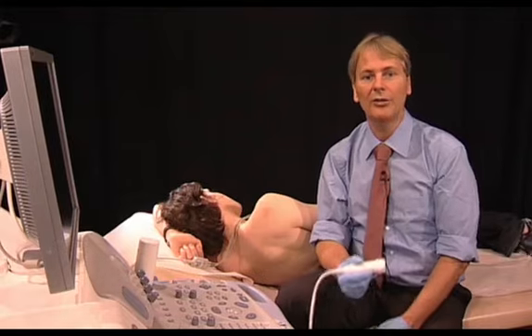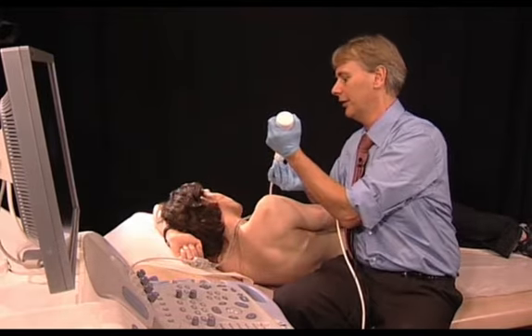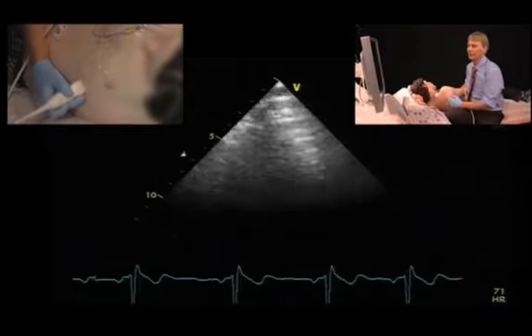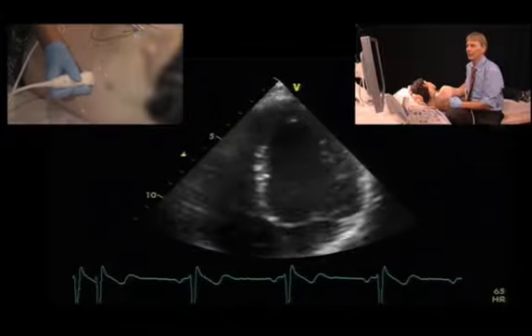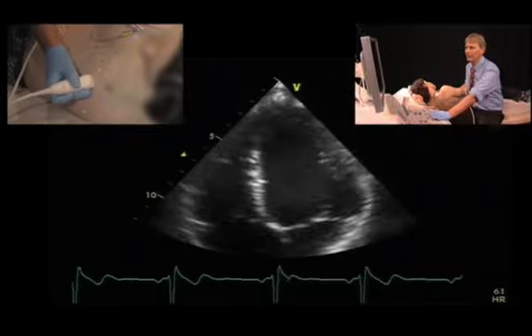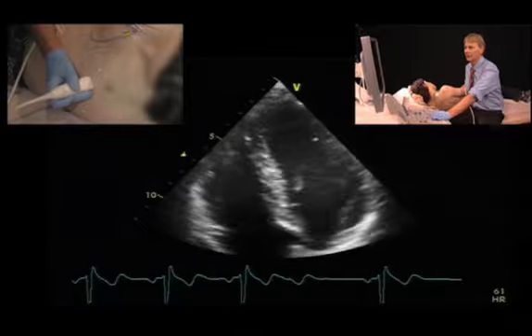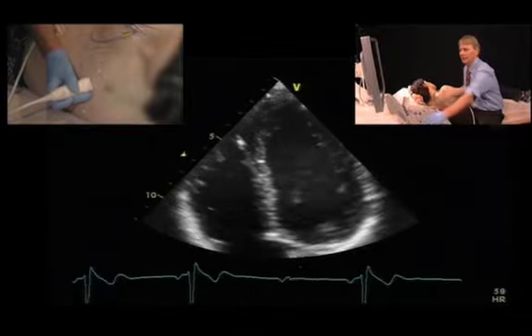To quantify the volumes, the most important thing is to get a good image quality of a 4-chamber and a 2-chamber view. So I'll show you some of the pitfalls or some of the problems. One problem usually is that we do not get a good resolution in the lateral wall. So often it's good to have the patient exhale a bit. And then once you get good image quality, let's increase the gain a bit.